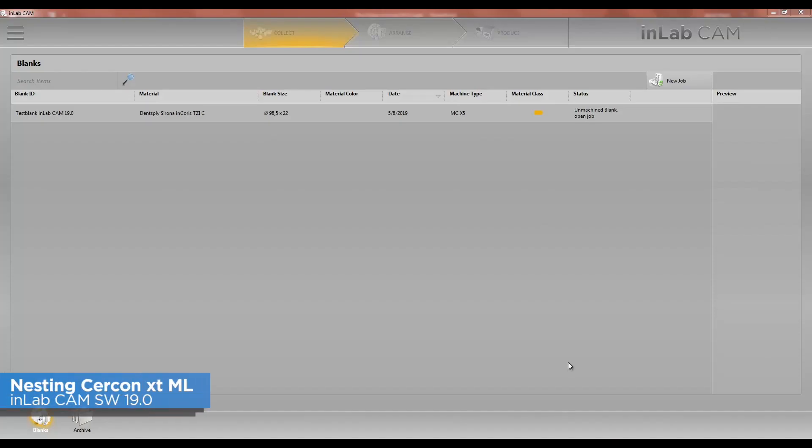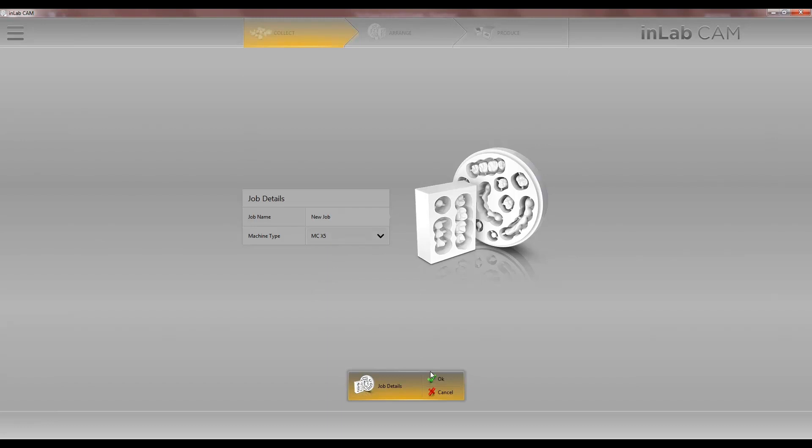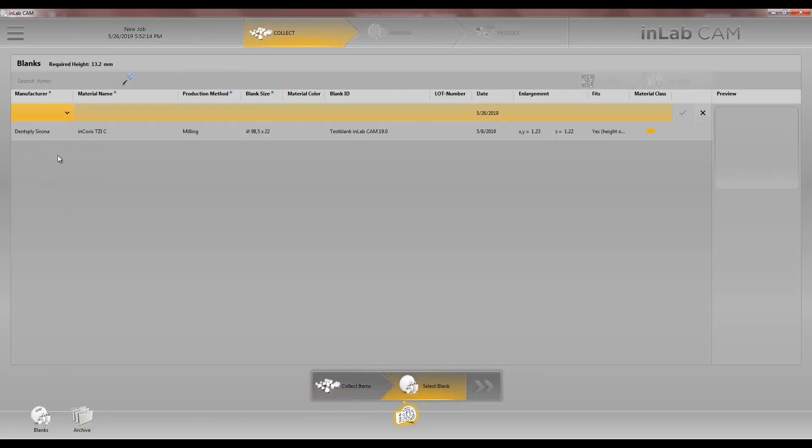Hello, this is Jay Black with Tekken 2. In this video we're going to go over how to nest our Circon XT multi-layer in the InLab CAM19 software. First thing we're going to do is go to New Job, choose MCX5, choose our restorations we want to nest, select our blank, click on New Blank, and choose Densify Serona.